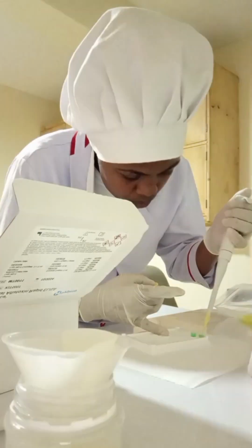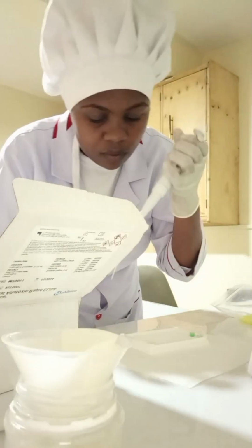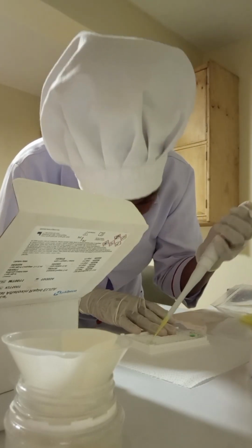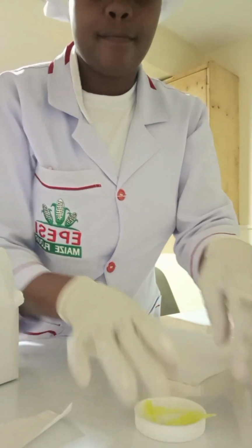Now you take a new pipette tip. You pipette sample A to clear coated well A, and then another tip unachukua unaweka sample B to B. Immediately you start running the timer for 15 minutes.